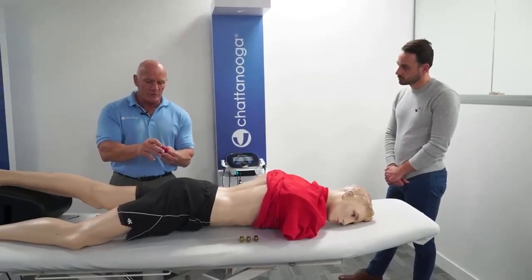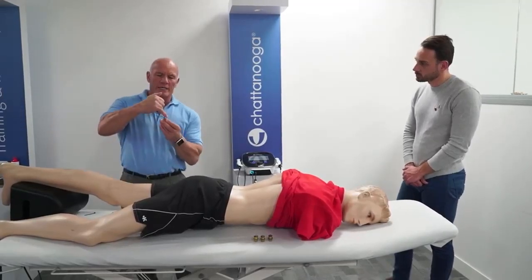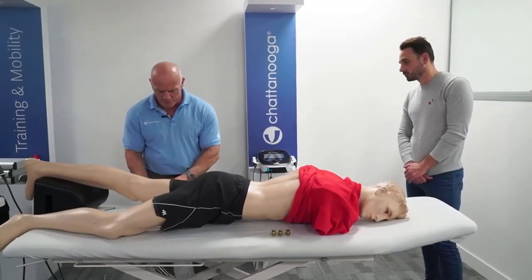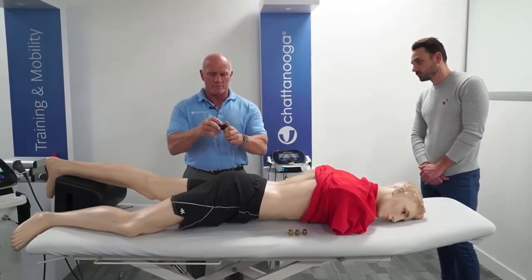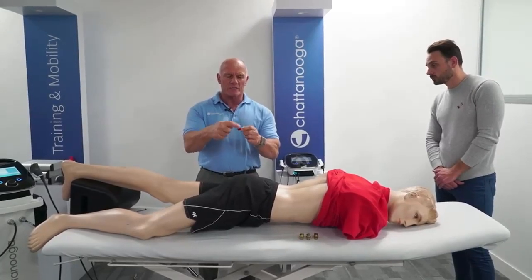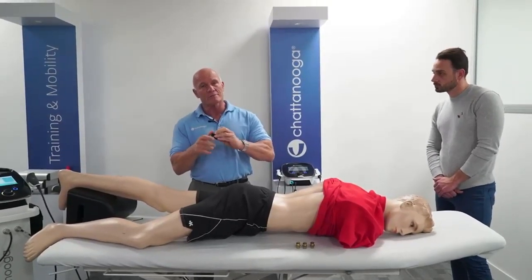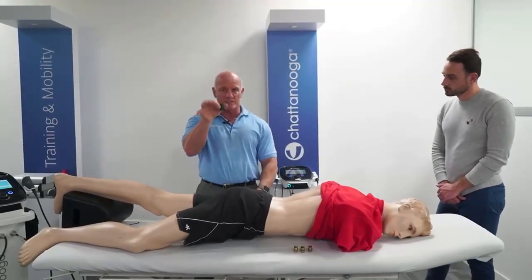So just take your transmitter out. You might well find that the gel has dried around there. So simply wipe it off with a damp cloth. And your D20 comes in two parts. Again, you may well find that the ultrasound gel is around here. If you allow that to build up, guys, it will stop that rattle. So you're effectively losing one of the functions of this very clever transmitter.